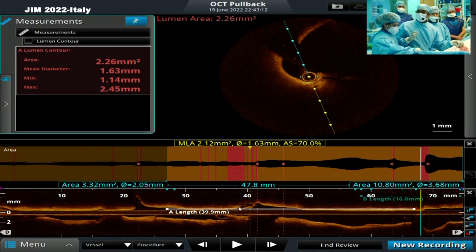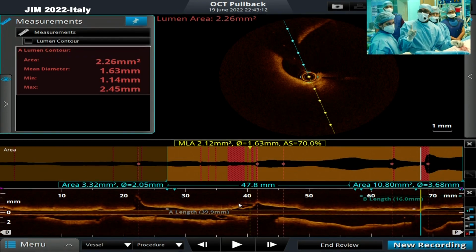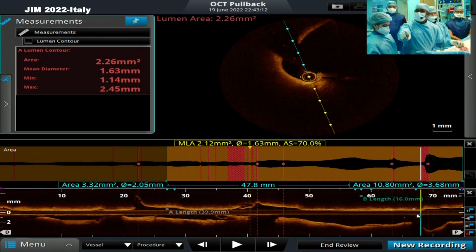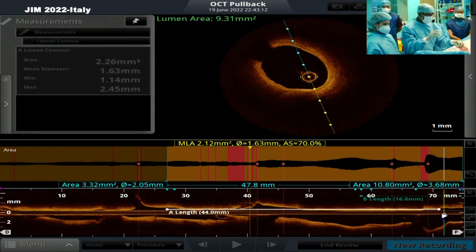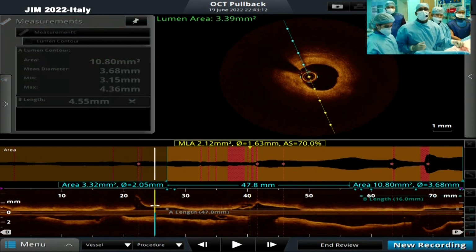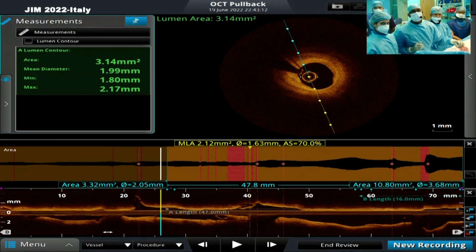Yes, that's what I'm interested in, because I have an alternative stenting technique to propose to you: to stent only from the ostial LAD and on. Just show the length from the ostium of the LAD to the first diagonal ostium. That's what makes a good discussion, to have alternative options. So you would want to avoid left main stenting, is it?